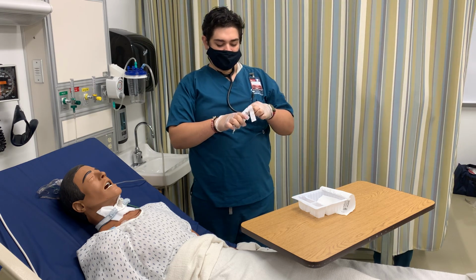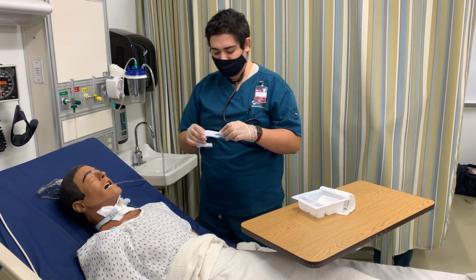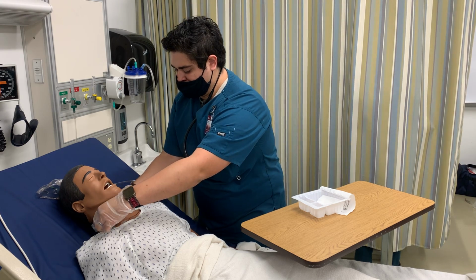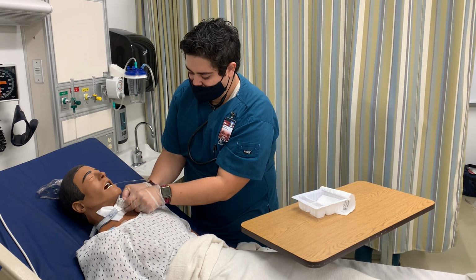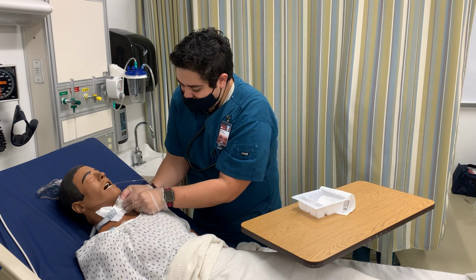I have a clean trach tie that I will be replacing his old one. So can you help me lift your head a little bit? Yeah. Before I remove the old trach ties, I will be attaching the new ones.